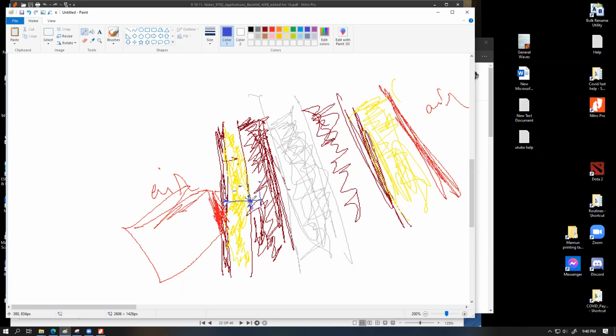Then the amount that is reflected will eventually come back to the source and it can be detected. Then the remaining transmitted part will keep traveling through, and now it will be hitting the bone. I'm not going to go further down. I could, but for the timing I'm deciding not to, because I'll go through the example for brain as well. This is the hardest surface, so this sound will be mostly reflected off the bone surface, and it will once again travel through here.